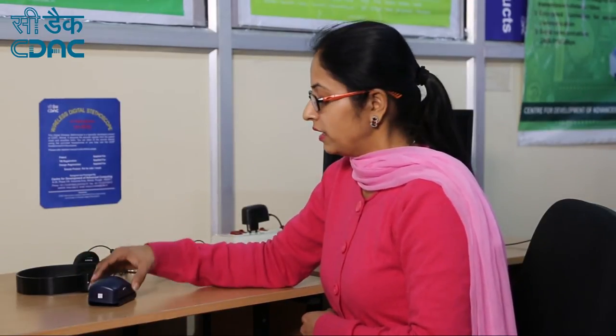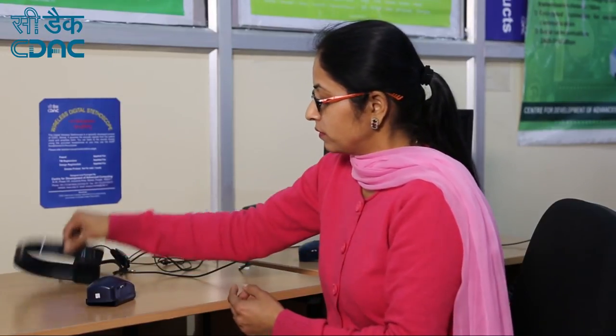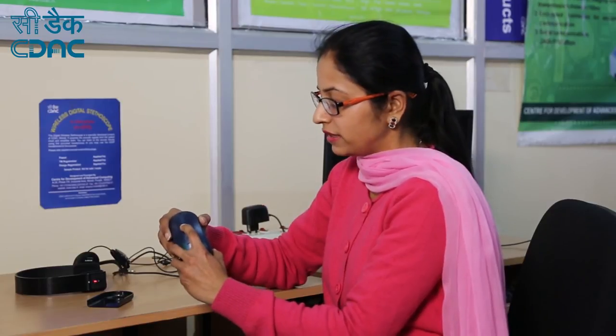Now, how to connect the device with the Bluetooth headphone. First, put the slider switch to its on position. Switch on the Bluetooth headphone. Then press and hold the main power switch for 3 seconds to switch on the device. The green light will show on the device, indicating both devices are connected. Now place the device at the desired location to hear the cardiac sound on the headphone.